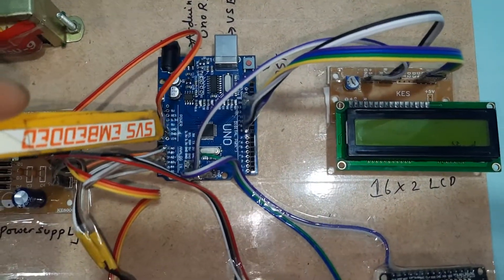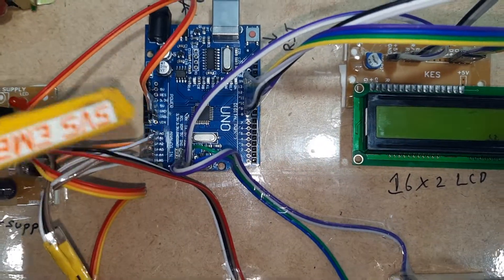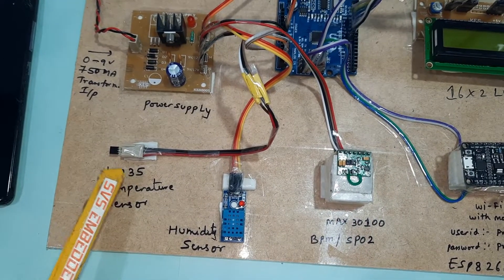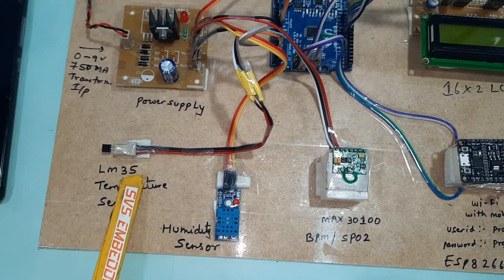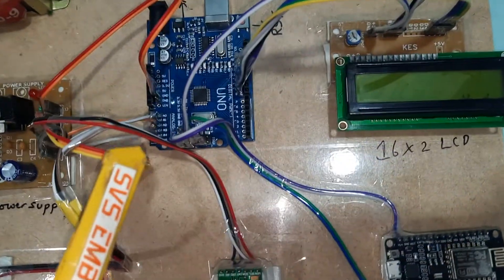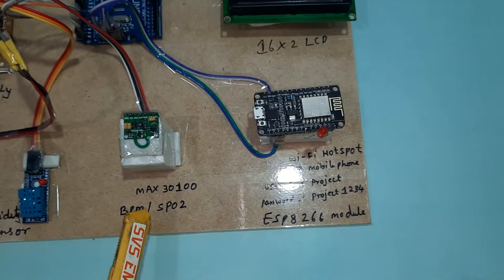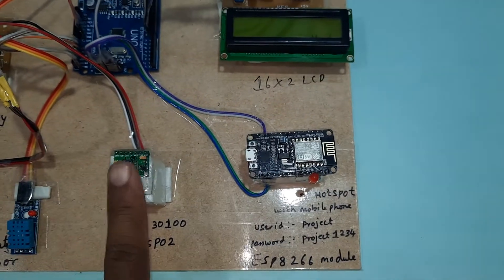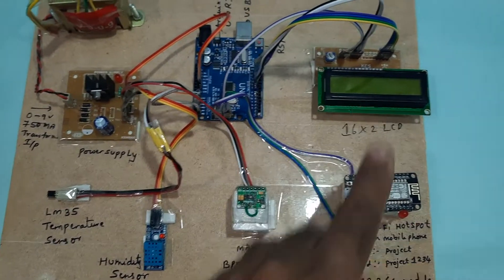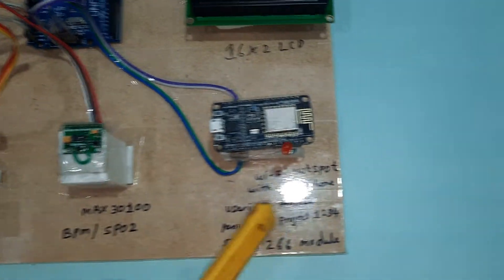The Arduino has analog pins A0 through A5. A1 is connected to the LM35 temperature sensor, which measures from minus 55 to 150 degrees Celsius. A2 is connected to the humidity sensor for room humidity measurement. The MAX30100 IC is connected via I2C to read heartbeat and SPO2 oxygen level.